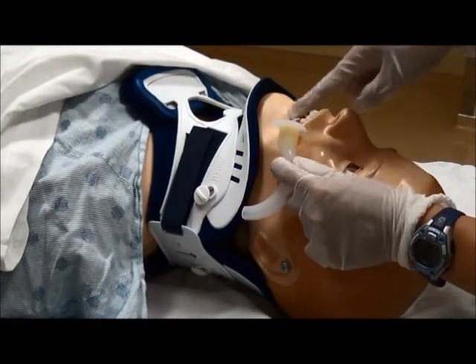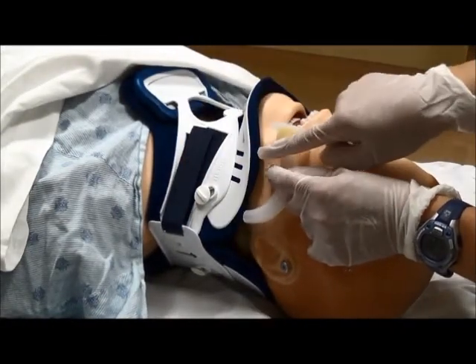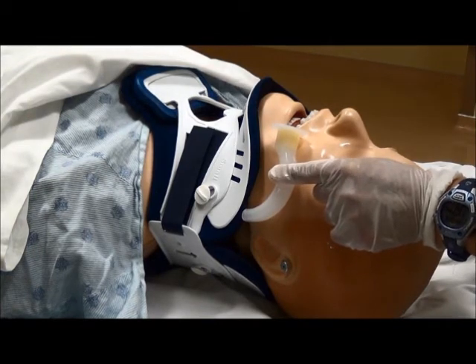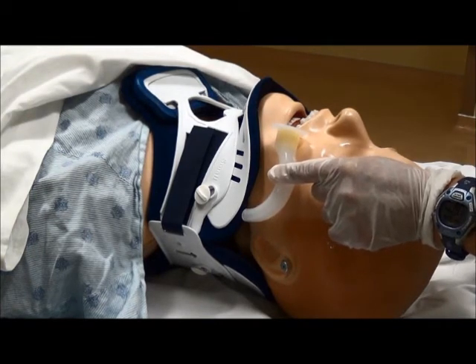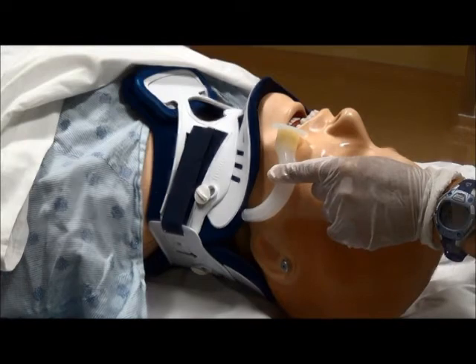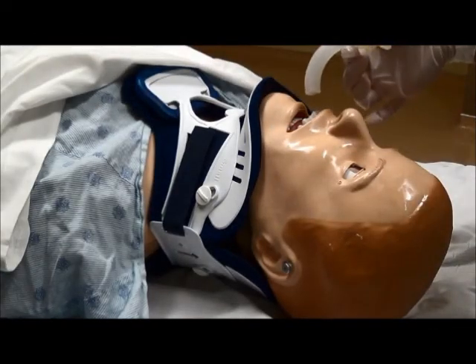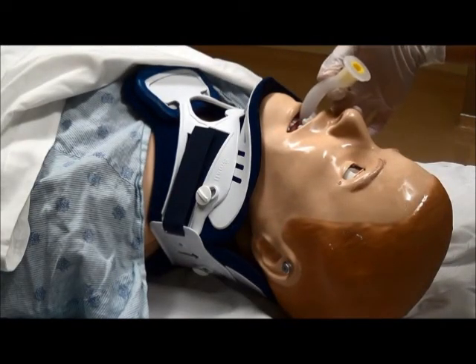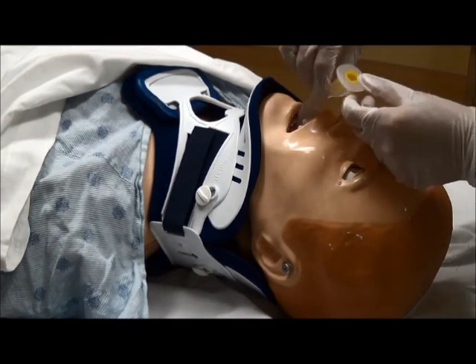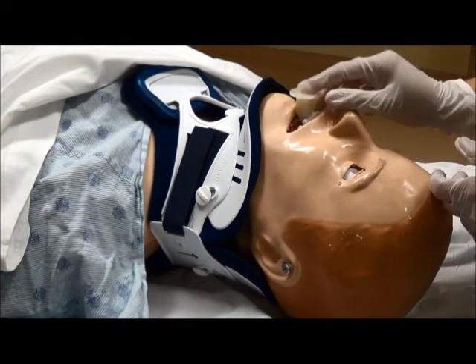To select the correct size, the length of the oral airway should be from the patient's mouth to the angle of the mandible. Insert it by pointing upwards into the patient's mouth to prevent it from hitting the tongue, then rotate it 180 degrees and continue insertion.